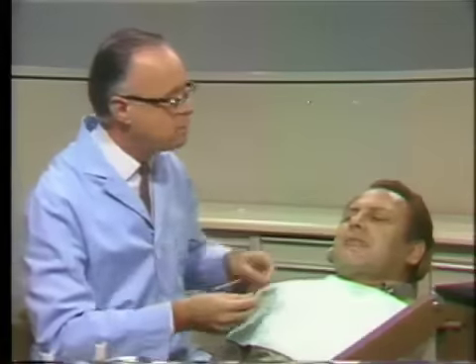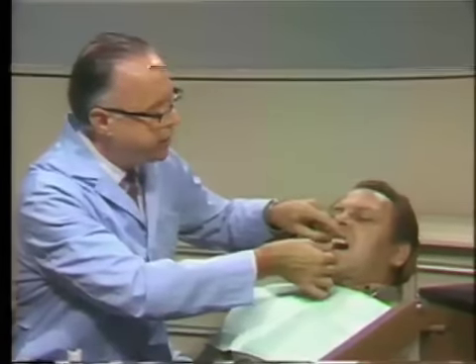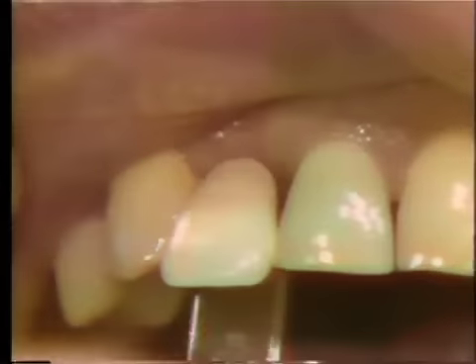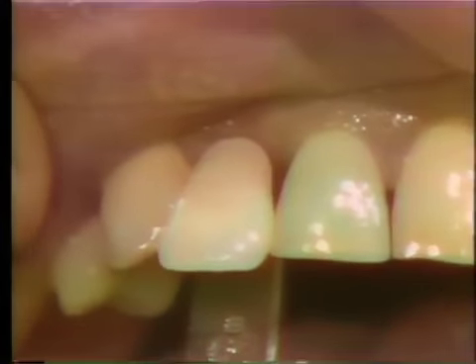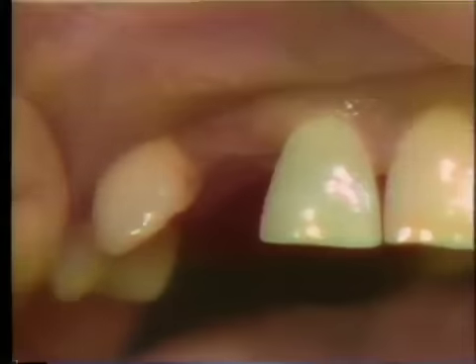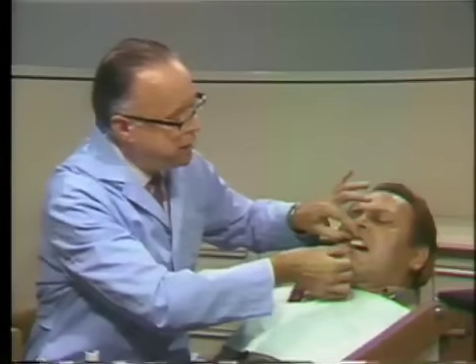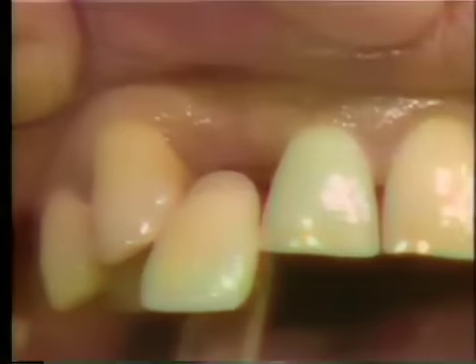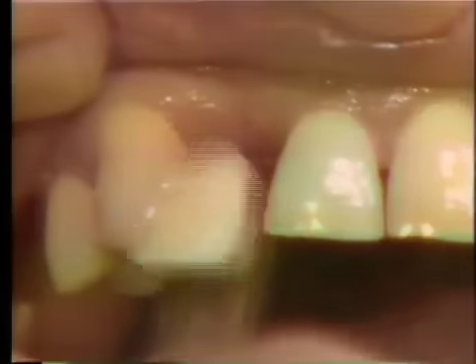And so just as a trial shot, we'll select one of those and put it in position in here and take a look and see how it compares with the teeth on either side. This is shade 66, and it's a pretty good match as I see it from here in this particular lighting. We'll try 67 just to see how that goes, whether we're getting a little darker, a little too dark, or whether it's a little better match. And as I see it from here, I think that probably I would prefer the shade 66, which is a little bit lighter than 67.